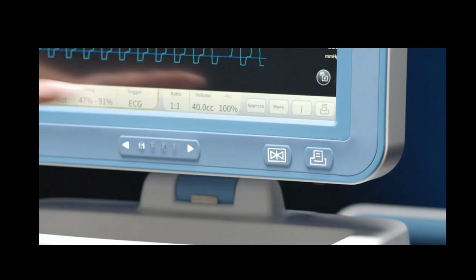Prior to leaving the cath lab, it is recommended that the interventional cardiologist should print the IABP monitoring waveforms and analyze the timing prior to leaving. As well, they should reprint and analyze timing if there's any timing concerns.